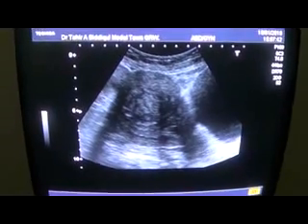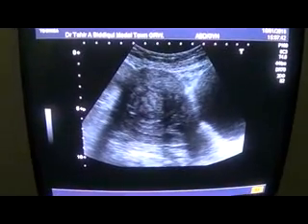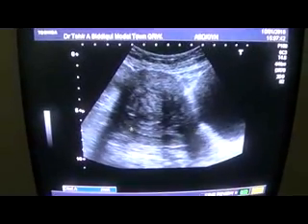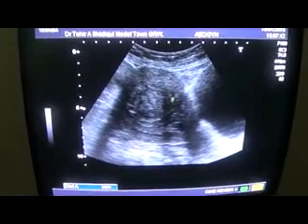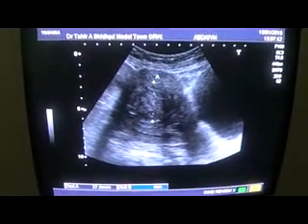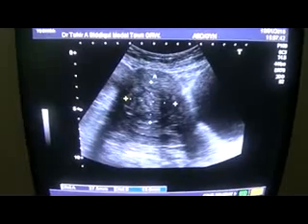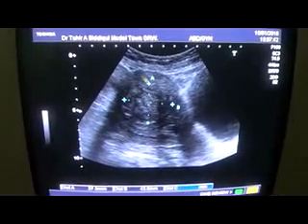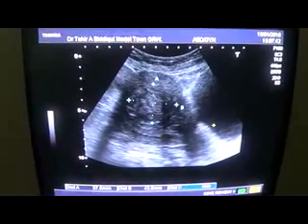Now here I have focused an image of the uterus of a 50-year-old female. What we see is the longitudinal section of the uterus, where this is the anterior myometrium, and this echogenic area giving a whorled appearance is a fibroid in the intramural or submucosal region, you can say. That is, this is a submucosal fibroid, and this is the posterior myometrium, the cervix.